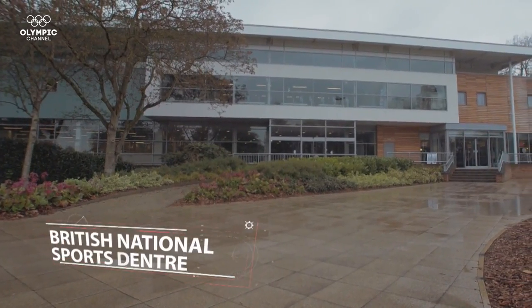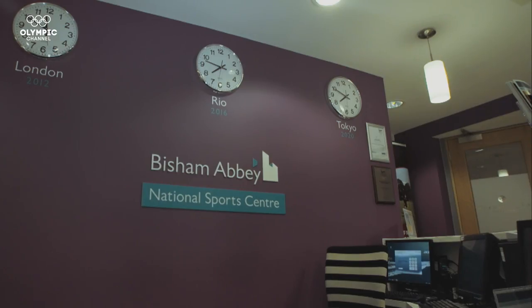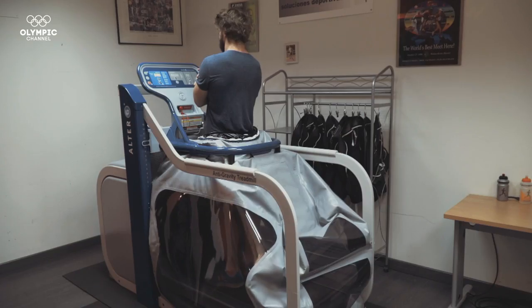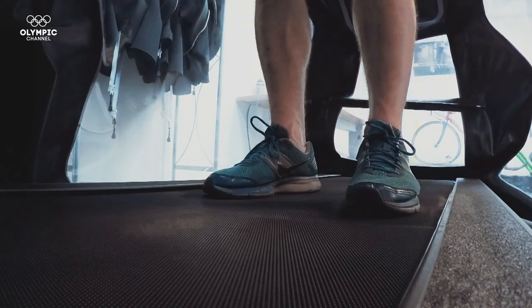In Bisham Abbey, at the high-performance centre of the English Institute of Sport, we've been able to understand how this technology works. It's a regular treadmill, but it kind of sits in a balloon that essentially lifts the athlete up slightly, so it reduces their body weight, so they can run along in a normal running fashion without the full weight of their body whilst they run.